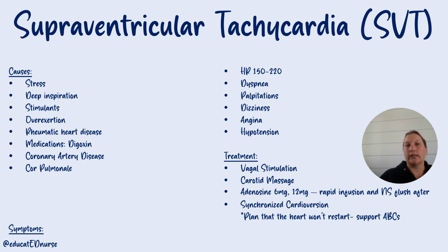They're going to get a shock, and they're going to be awake, and most patients say, God, I feel like I just got hit by a semi, or I feel like I got kicked in the chest by a horse, okay? They feel that, and sometimes the skin will burn, the hair will burn, so try and sedate them if you can, or at least give them some medication like Versed or fentanyl or morphine, just to make it a little easier on them. But if they're unstable, you just got to do it, right? And just like with adenosine, just prepare that the heart might not start up again on its own. So have all your airway, oxygen, breathing, and circulatory support stuff ready to go in case it doesn't.